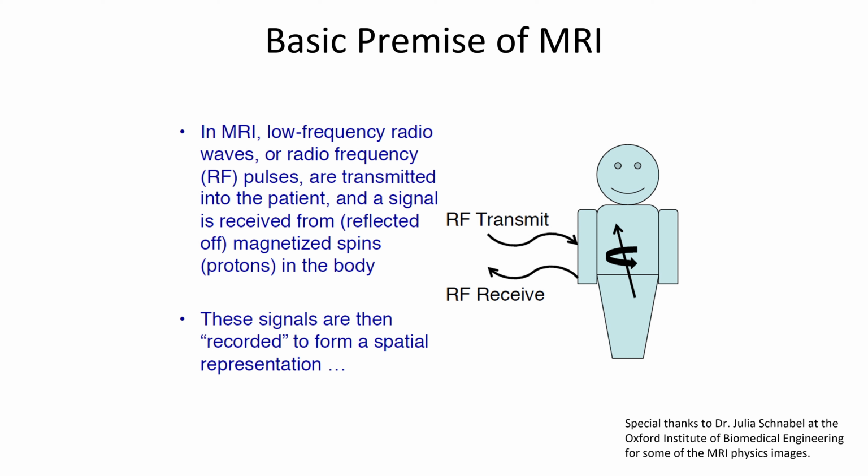And then we're going to send a radio frequency pulse right into your body, and that, remember, electromagnetics, every photon carries an electromagnetic component, so this is going to have a small magnetic field, and it's going to tilt the angle of that alignment of protons in your body. It's going to tilt it slightly just for a brief moment.